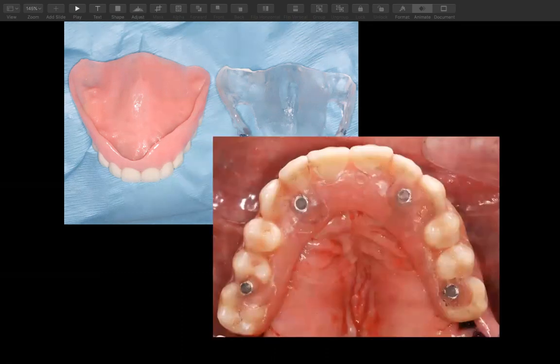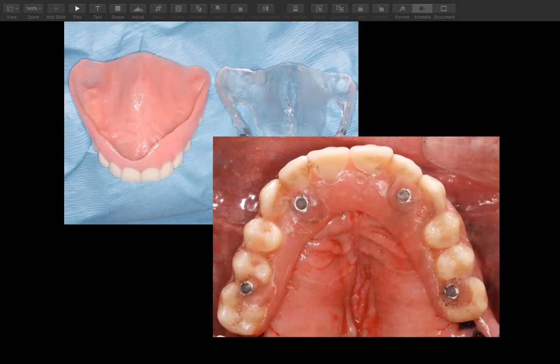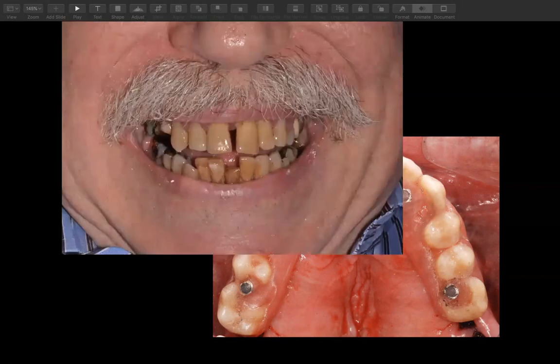These are what they kind of look like the day of surgery. It looks like they've been through war a little bit, you know, with the pickup material. But typically, this is what it'll look like, I think, once you get a little bit more experience with this. This will definitely look a lot better. I believe this photo here might have been done by a doctor chairside that I had gotten from one of my clients.